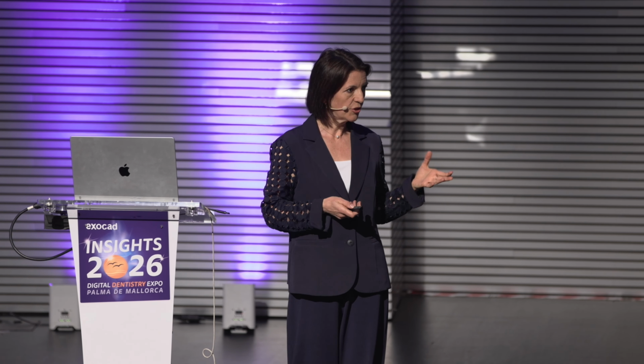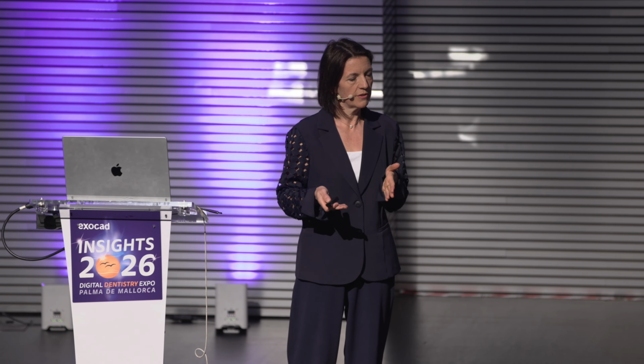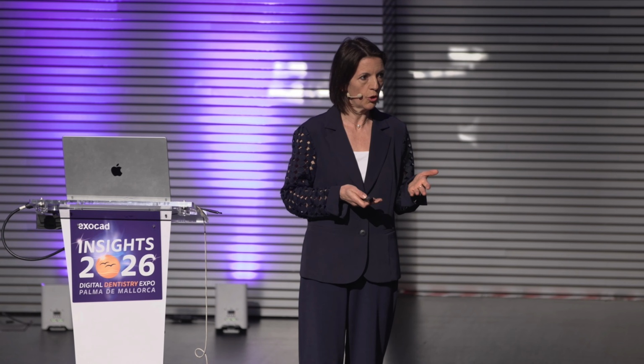Smile design is hugely important as a motivator in the visual storytelling process. And again, now we have numerous tools to be able to help patients visualize the potential of the dentistry that we're talking about. But I think all of these technologies also help us initially. We need to think it through as clinicians and treatment planners. If we do this treatment, if we move the teeth, how does that help us deliver the expectation of the patient? If we move the teeth, do we still need to restore them? If we don't move the teeth, how are the restorations going to work, or what's the biological cost of those restorations?